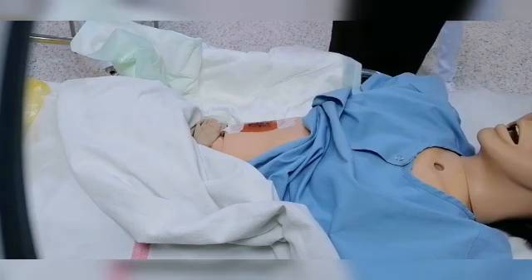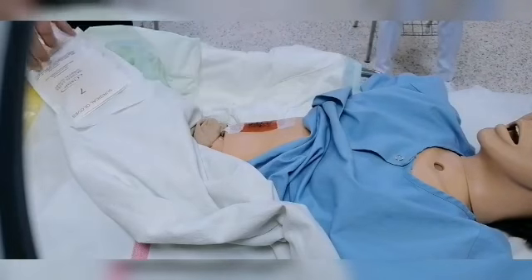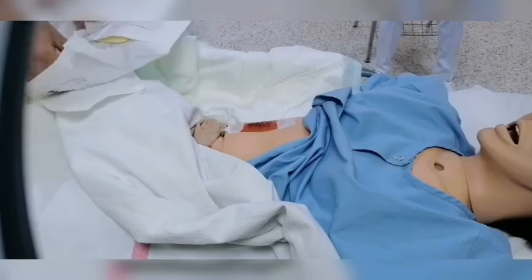For any sterile object, usually there is a side that I can peel it from. So from here, yes, I will peel it. Without touching the gloves from inside, I will insert my hand.